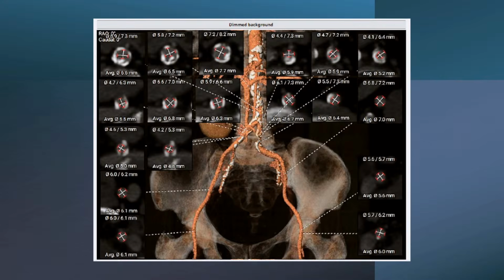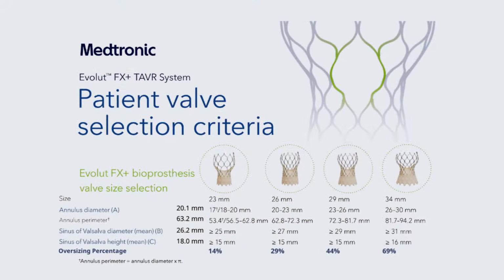So because of this, we decided that we will consider using peripheral IVL, so we can have a good preparation and it will be easier for us to pass our valve. Otherwise, we were anticipating quite some difficulty. We thought we would decide based on how we are doing during the procedure.